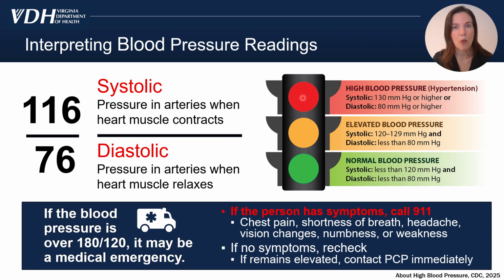You want to have them sit quietly and recheck. And if the reading still remains elevated, over 180, over 120, then you want to contact the person's primary care provider for guidance immediately.